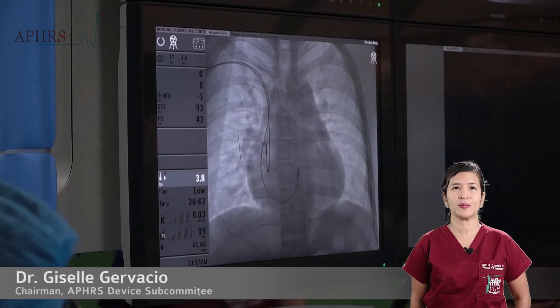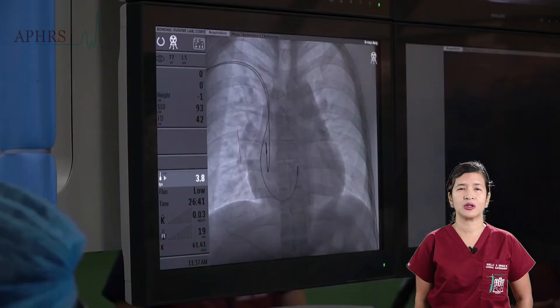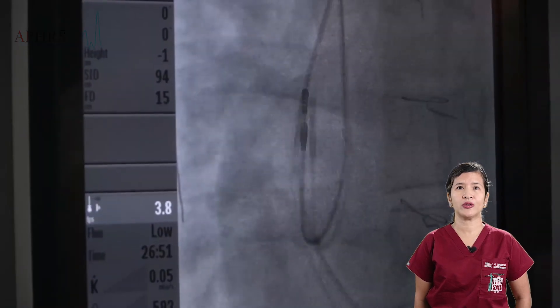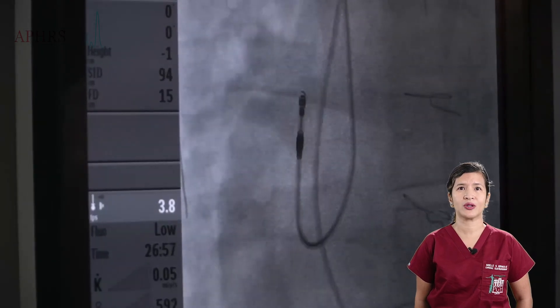One confirms positioning in the appendage by a swinging motion of the right atrial lead. The screw is deployed similarly by clockwise motion of the pinching tool until, under a magnified fluoroscopic view, one can confirm full deployment of the screw.